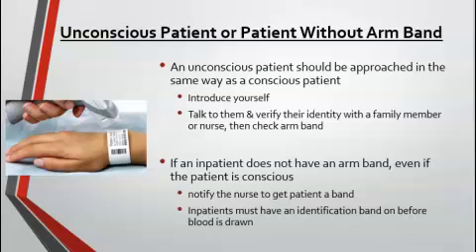If you come across the scenario where a patient does not have an armband, even if the patient is conscious, you cannot complete the blood draw, especially if that patient is an inpatient. If the armband is not available, or if the patient doesn't have an armband on, you need to immediately notify the nurse for the patient in order to get an armband placed on the patient before the blood draw can be completed.